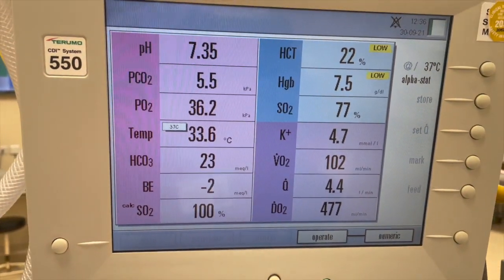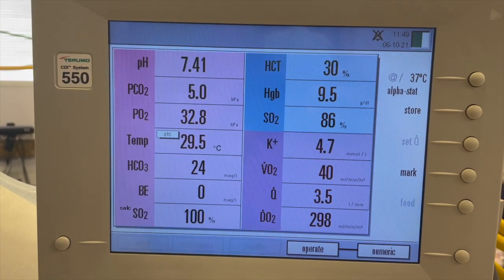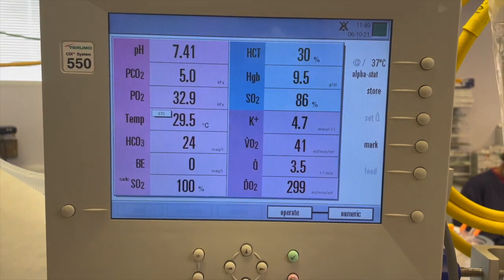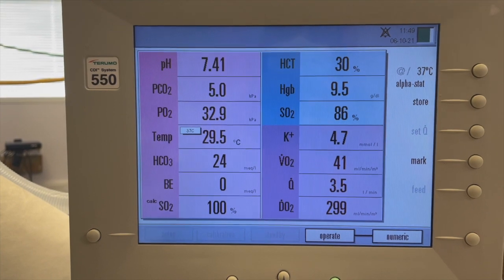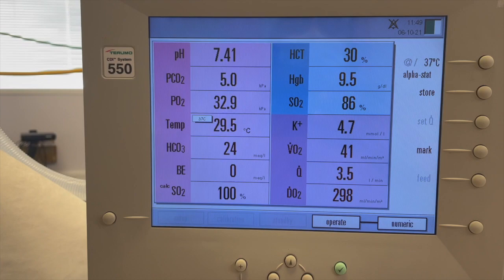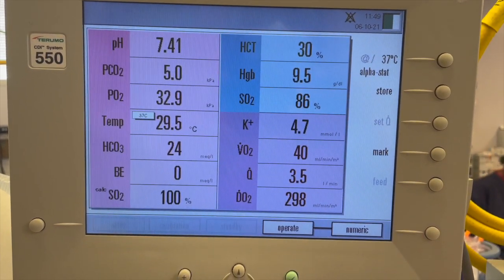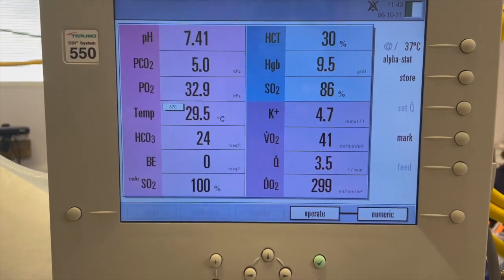The CDI 550 is capable of monitoring VO2 and DO2. VO2 indicates the amount of oxygen consumption by the patient during bypass, and DO2 is another important indicator for perfusion. Oxygen delivery and oxygen consumption values provide the perfusionist with valuable information for the maintenance of optimal metabolic performance of the patient while being supported on cardiopulmonary bypass. This helps assure that all critical organs, including the brain, gut, liver, and kidneys, are having their individual oxygen demand needs met satisfactorily.